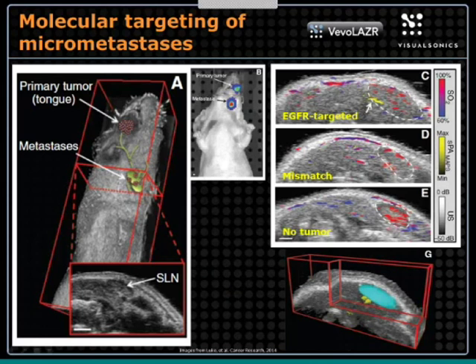So we can't see them yet with ultrasound, and yet we can see photoacoustic signal that's coming from particles that have been taken up by those cells. So we can therefore identify metastatic cells even before we can see it with just the regular ultrasound. So this is a great example of true molecular imaging for detection of metastasis using this material from Nanohybrids.